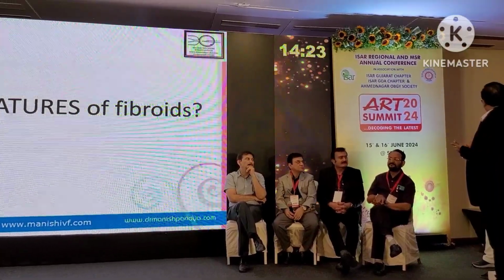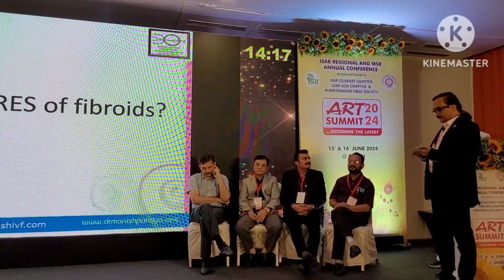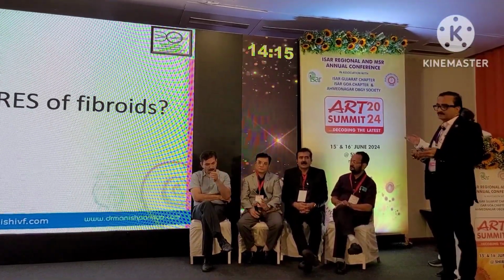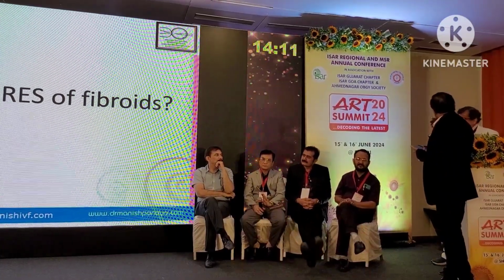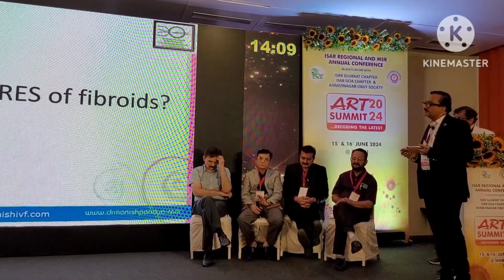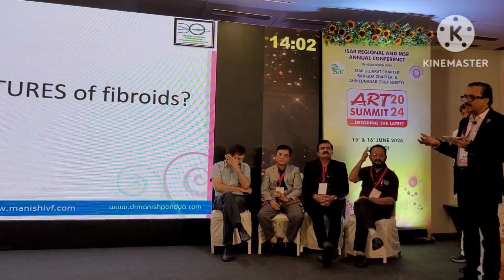Basically, all the polypoidal endometrium is supplied by the uterines only. It's the excessive flow from the uterine which makes it grow for obvious pathological reasons. But at the same time, as Manish has already mentioned, there is a single vessel which you will be able to identify, if not on color Doppler alone, you can use power Doppler for enhancement and you will get it. You will get the vascular pattern because it is the arterial supply.